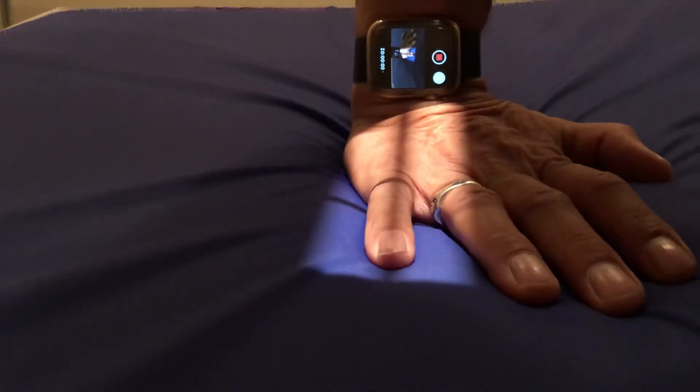You clicked on this link because you want to know how to take an x-ray of a little finger, and I'm going to show you how to do it perfectly, every time.